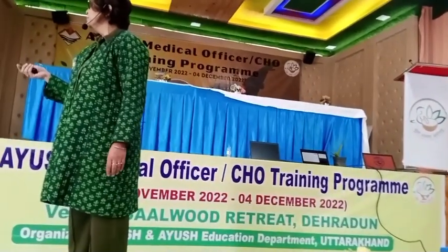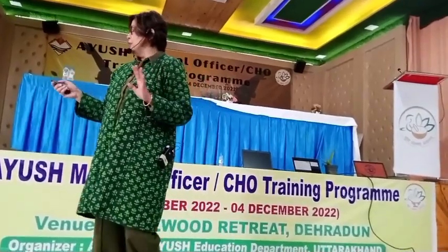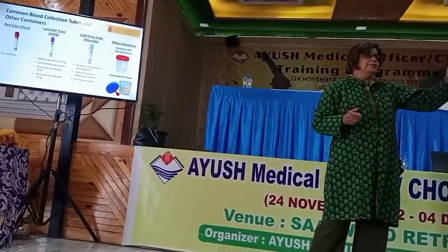Okay, so now once the sample is taken, and as I had mentioned about these vacutainers, we need to mix the sample.